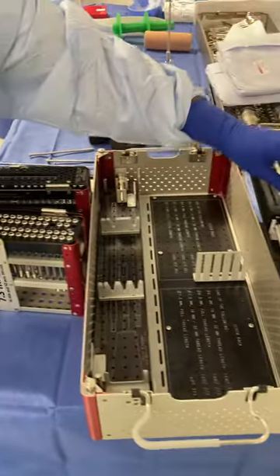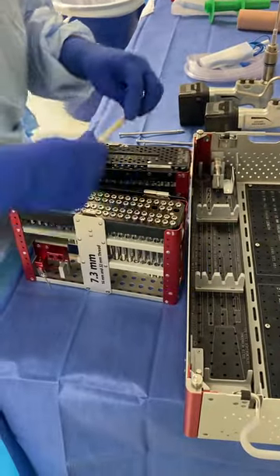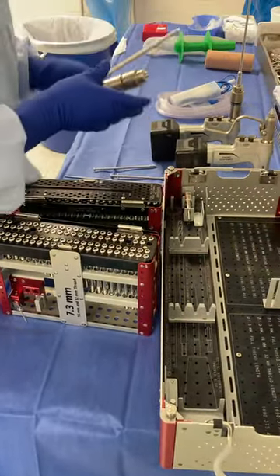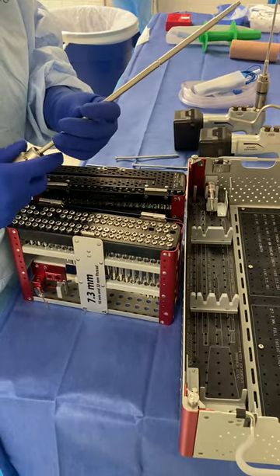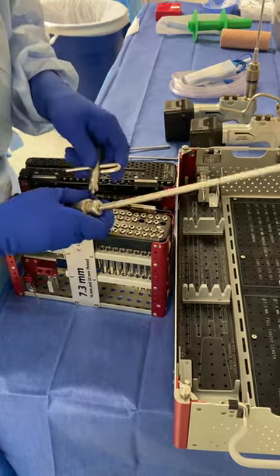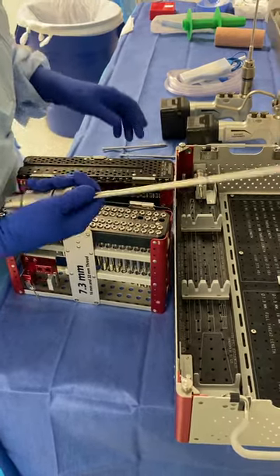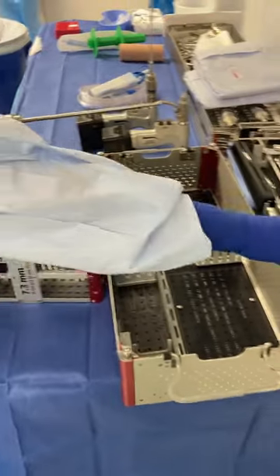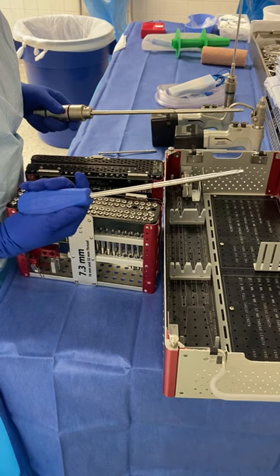The screwdriver for this set also has the same attachment that we don't have in our drills. So I put that on a reamer head — we have resonance here and I like for them to put it on. You can put this on a red or a green head. Once I get the screw all the way down, he'll take the hand driver and tighten it the rest of the way. And that's it.